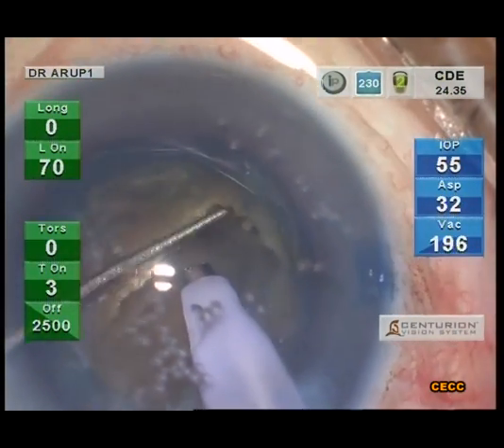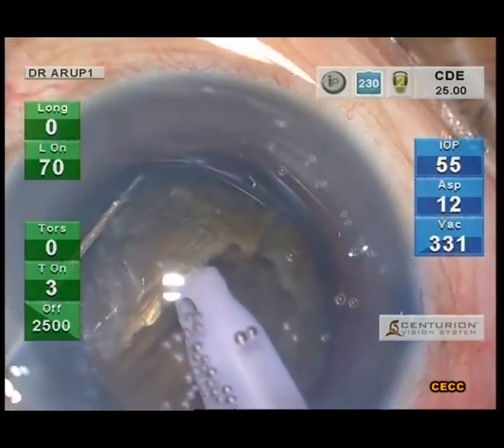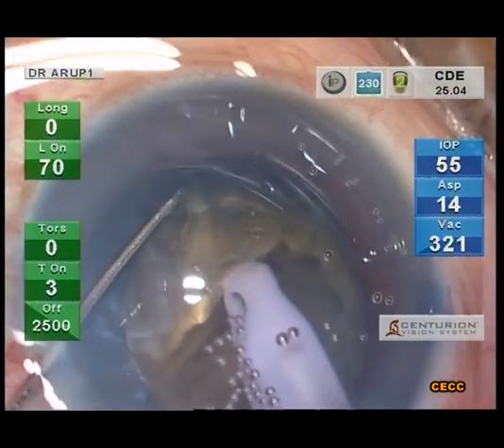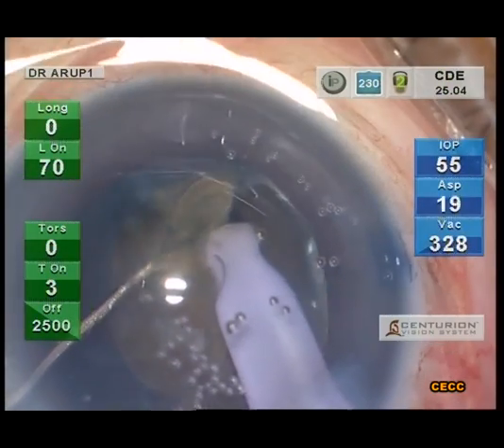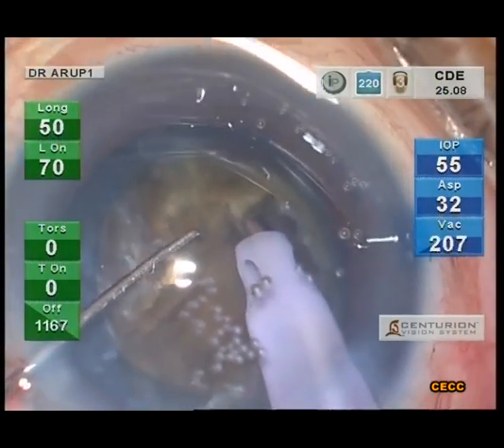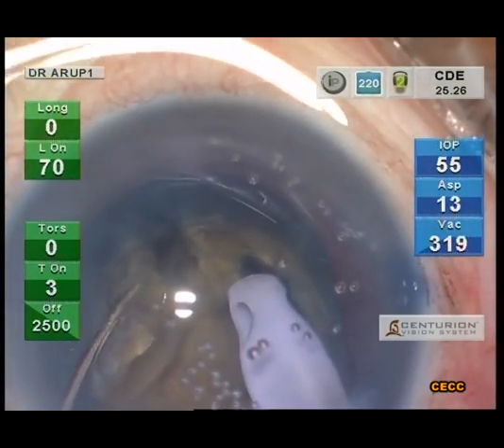The nucleus is turned 30 degrees and fresh chopping is begun. Whenever a tendency for nucleus tilt is noticed, the phaco tip is further driven deeper into the nucleus with an additional burst of power without withdrawing the phaco tip. At the end of this stage, a little wedge of nucleus is chiseled off from the main nuclear mass.